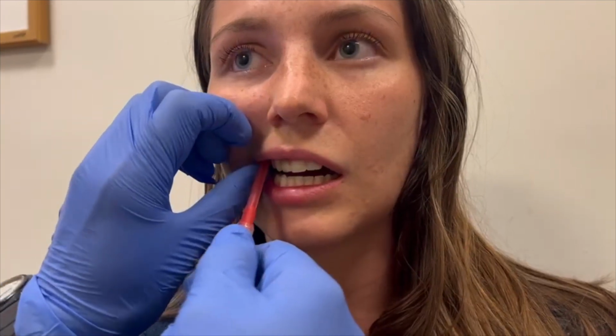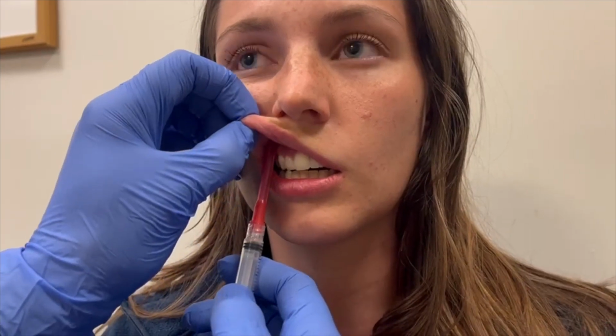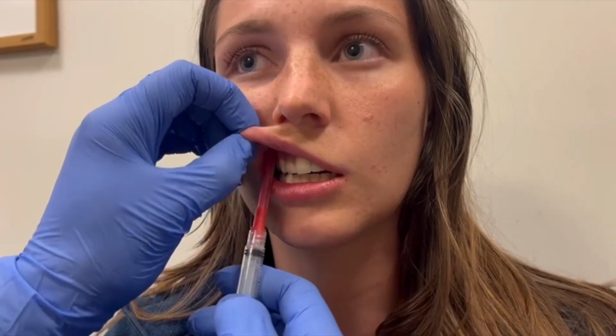Inject 2 to 3 mL of anesthesia through the mucosa in front of the second premolar, fifth tooth back, aiming upwards towards the foramen. This is the injection site of interest for the intraoral approach for the infraorbital nerve block.